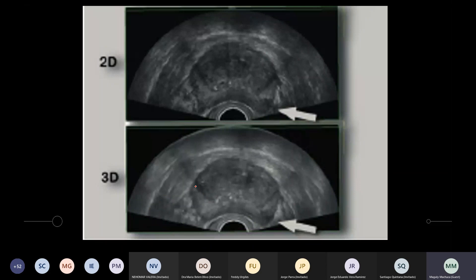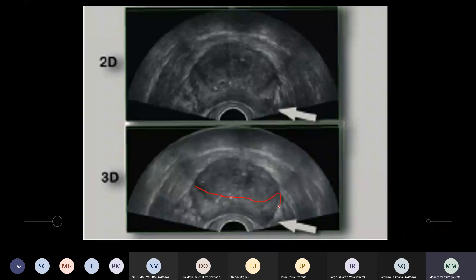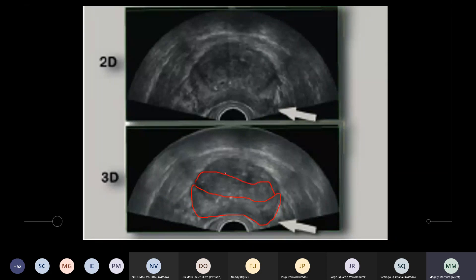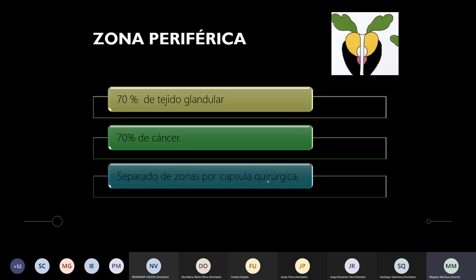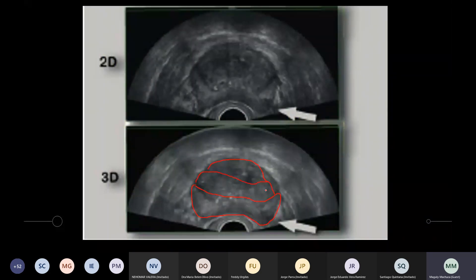Acá sería la zona periférica, todo esto más o menos sería la zona periférica. Acá arriba, todo esto sería la zona central, una parte de la zona central. Y este más o menos sería el estroma fibromuscular. Estas son las zonas que nosotros las vamos a caracterizar. Es importante porque ya dijimos que el 70% de los cánceres vamos a encontrar en la zona periférica.